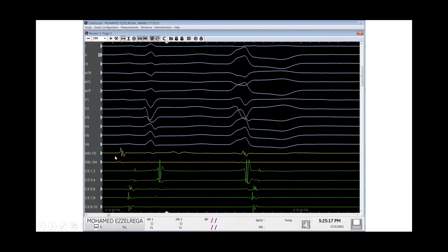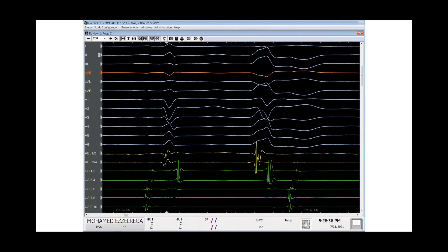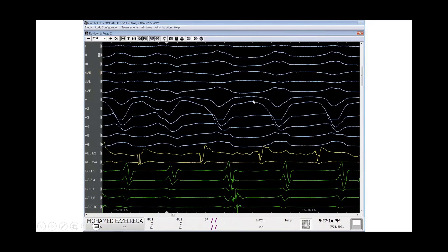We can see here the ablation catheter from distal to proximal and CS catheter from distal to proximal — sinus beats and PVCs. During catheter navigation and manipulation before starting mapping in the outflow tract, we moved the catheter in the outflow tract trying to get the earliest local activation time relative to the QRS complex. Some non-clinical PVCs appeared — catheter-induced PVCs — and clearly the QRS complex transition was very late, at V5, confirming we were mapping in the RVOT.